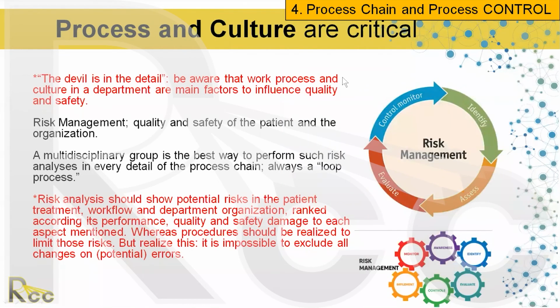And I mentioned this early. The culture is critical. So creating these safe processes and creating an environment where people are safe to call out errors or to call for a timeout, that's really important. Never rush through one of these critical procedures. We know there's more patients to treat after this one patient, but when that patient's there, that's who we should be focused on. And that's the most important person in the room. So getting it right is critical, and creating a culture where people are free to speak up is really important.